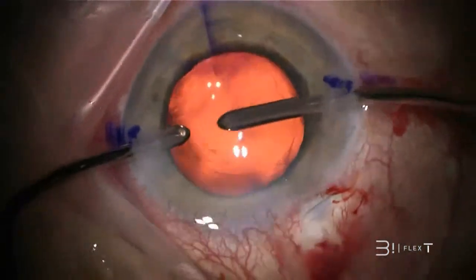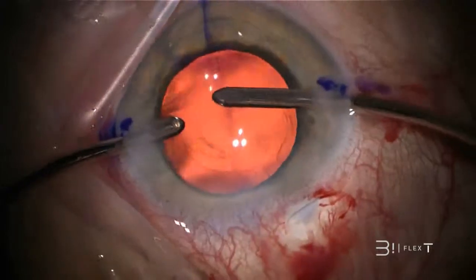With a capsular tension ring, not only does the lens turn easily, but it also then remains in the desired position.